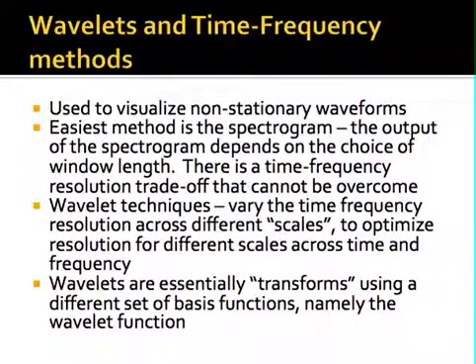And what makes a wavelet different is that at frequencies where you have slow variations, or close to DC type portions of the spectrum, you can choose a long window, and then in regions where you have high frequency variations, you can choose a very short window.